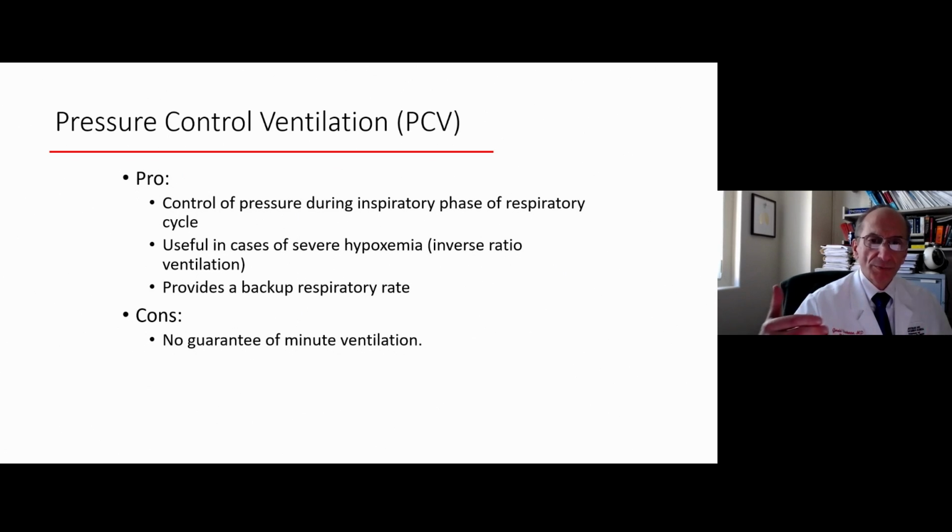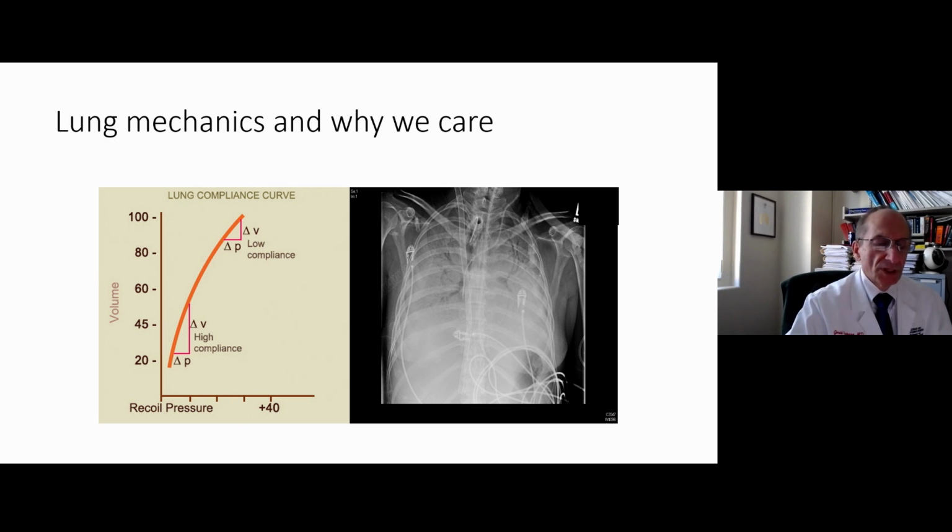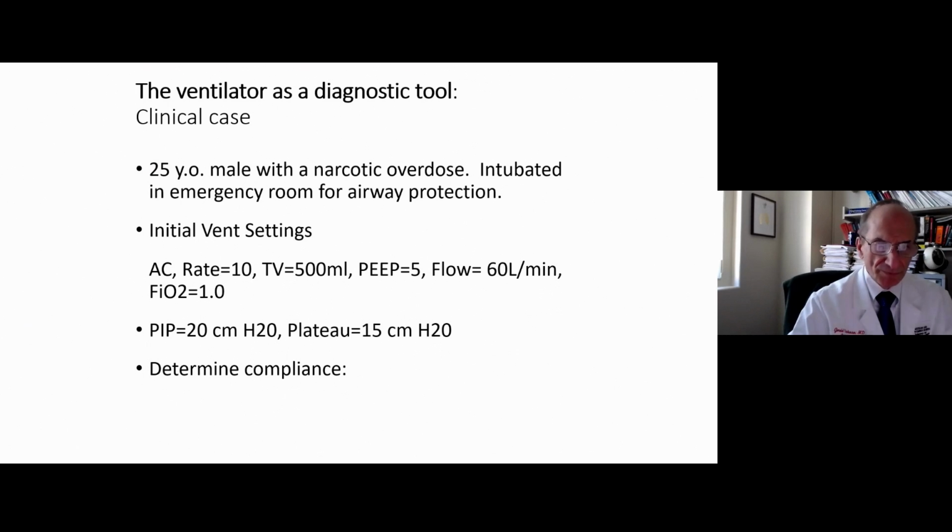Having a longer period of inhalation and inspiratory time can be very beneficial and allow for greater gas exchange. It does provide a backup rate, but again, because this is a pressure-controlled mode, there's no guaranteed minute ventilation. So let's talk for a bit about the mechanics and why we should care.